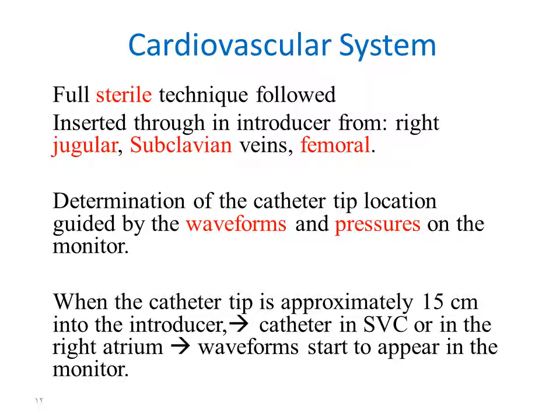So based on the waveform and the pressure reading we can determine the catheter tip location.